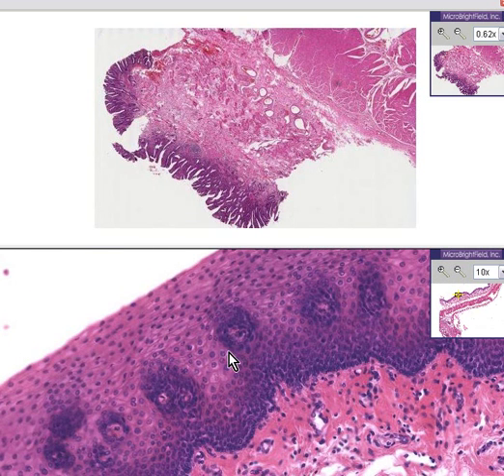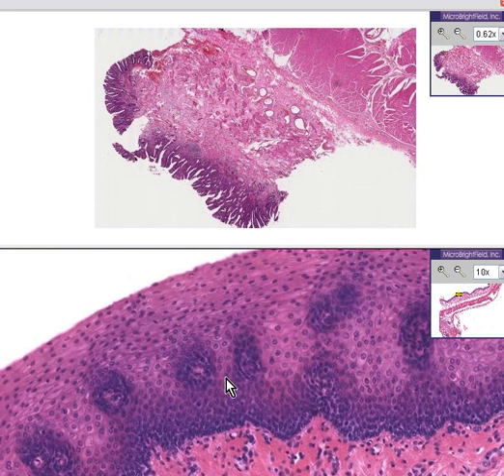You can recognize this as squamous with a more columnar type of epithelium on the bottom, cuboidal in the middle, and flattened or squamoid on the top. The mucosa is always named by the most superficial layer. This is normal.